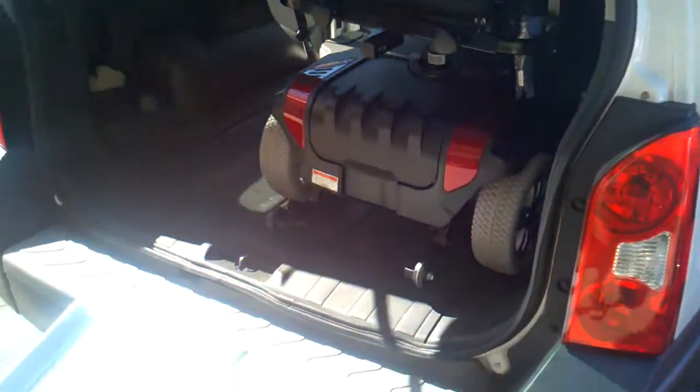Just like that. Okay, so now we're going to put it in. All you've got to do, like Nate showed you before, is push the seat to the flat position, and then turn it down all the way and put it right in the vehicle. Easy as that. Look at that. Done.